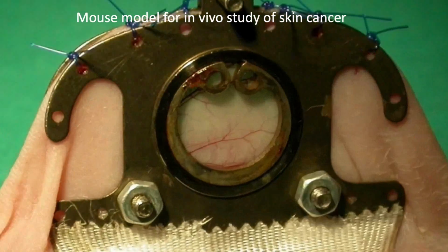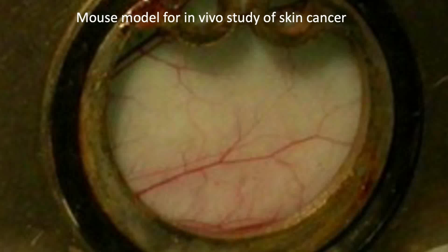In our lab, to longitudinally monitor the progression of the tumors by intravital multiphoton microscopy, cancer cells are implanted in the deep dermis of the mice within a dorsal skin fold chamber system. A dorsal skin fold chamber is an optical imaging window that is implanted on the back of the mouse, and it allows the in vivo inspection in real time.